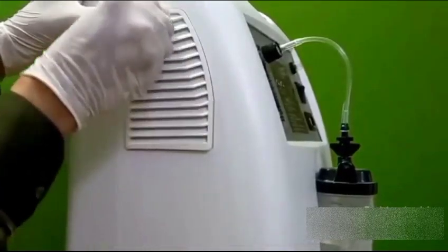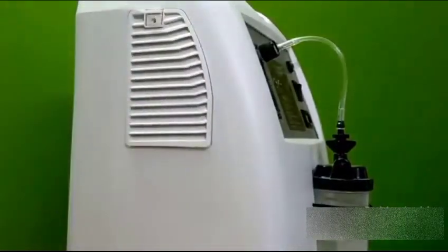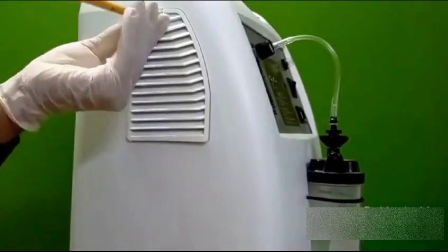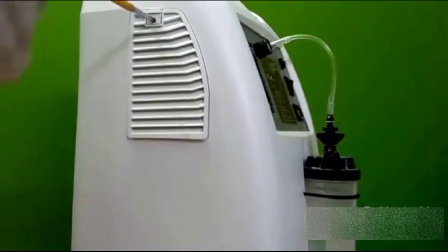So there were 2 filters, and you will be able to remove and install these filters correctly, as shown in this video.